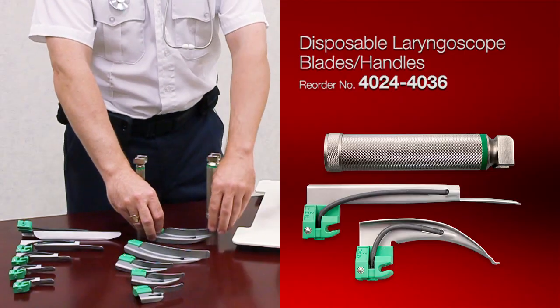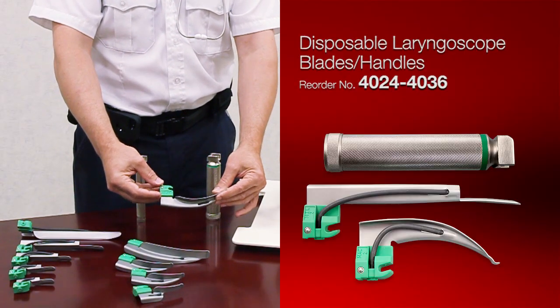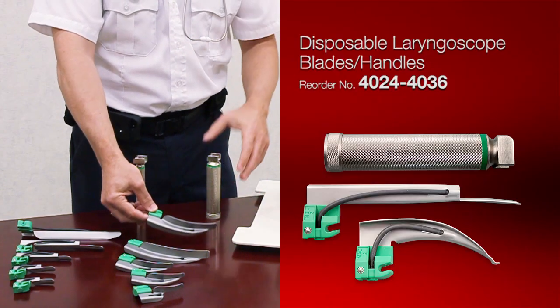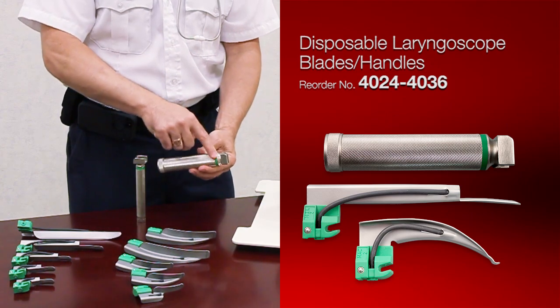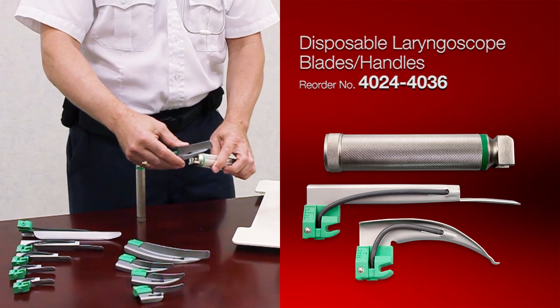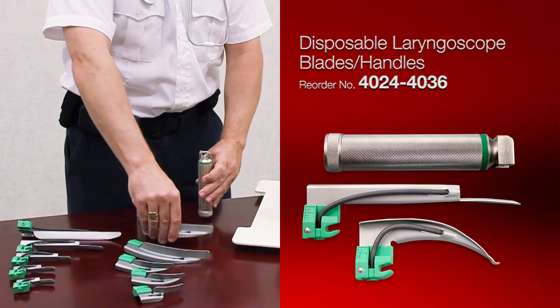The easy way to discern the fiber optic from any other laryngoscope blade or setup is the green. This is going to be a key for you — green means fiber optic. There's also going to be a green band on the handles. Fiber optic blades will only go on a fiber optic handle; they will not interchange with any other kind of light source.